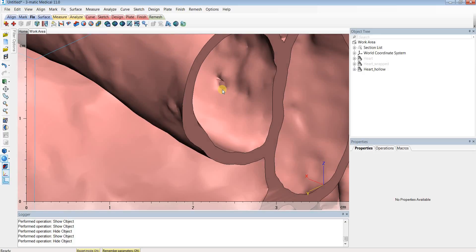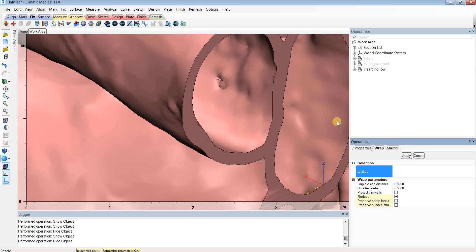When I did the WRAP operation, I even had the gap-closing distance set to 0. But those two vessels were so close that the distance between them was likely smaller than the detail level I chose.